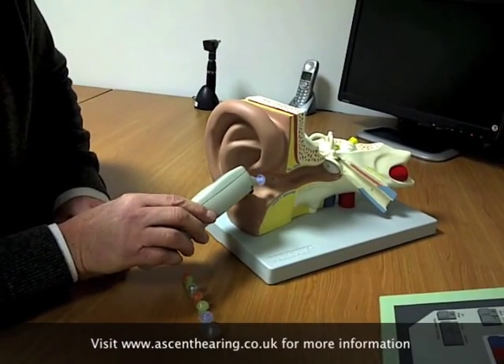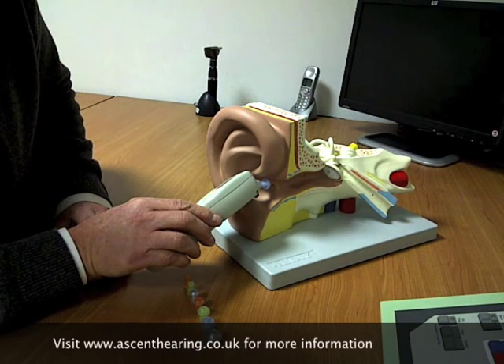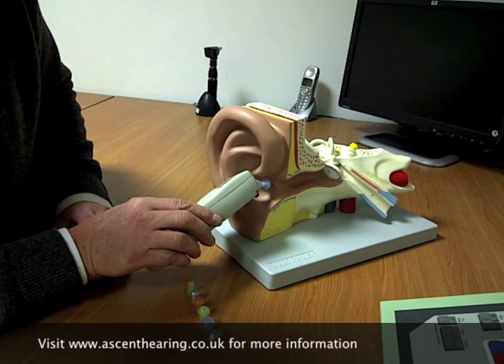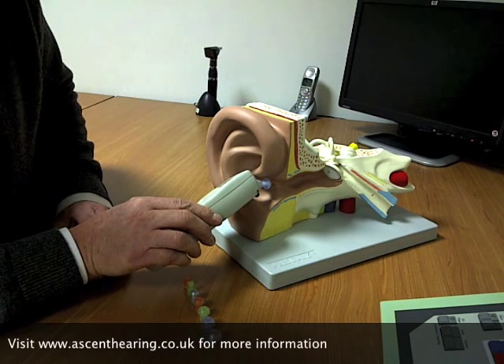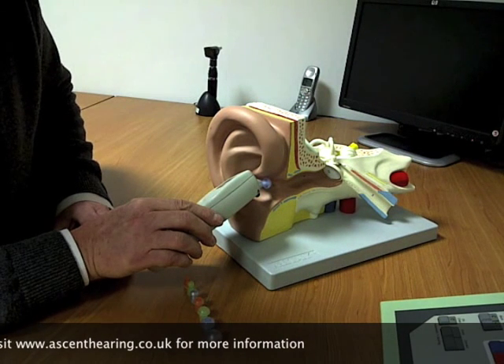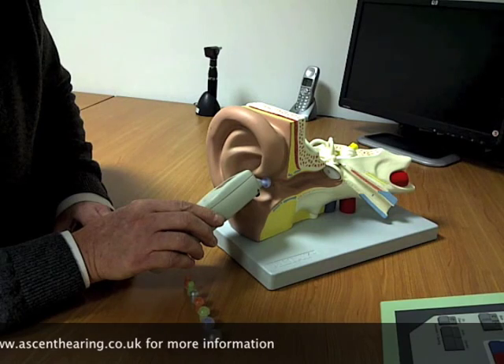On this particular model, the idea is you gently place the probe tip against the canal wall, seal around the canal wall, and then the actual measurement is made. In a subsequent video I'll explain exactly what the mechanics of the test are.